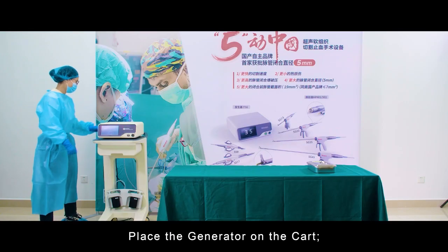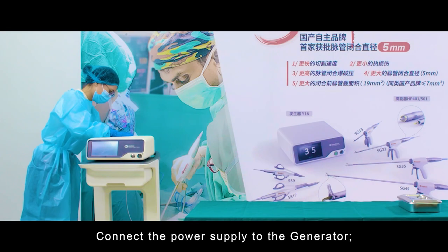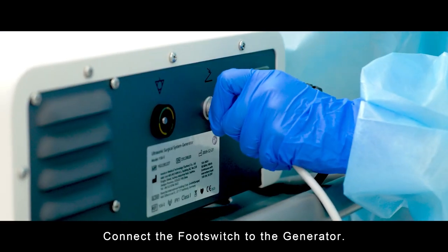Place the generator on the cart. Connect the power supply to the generator. Connect the foot switch to the generator.